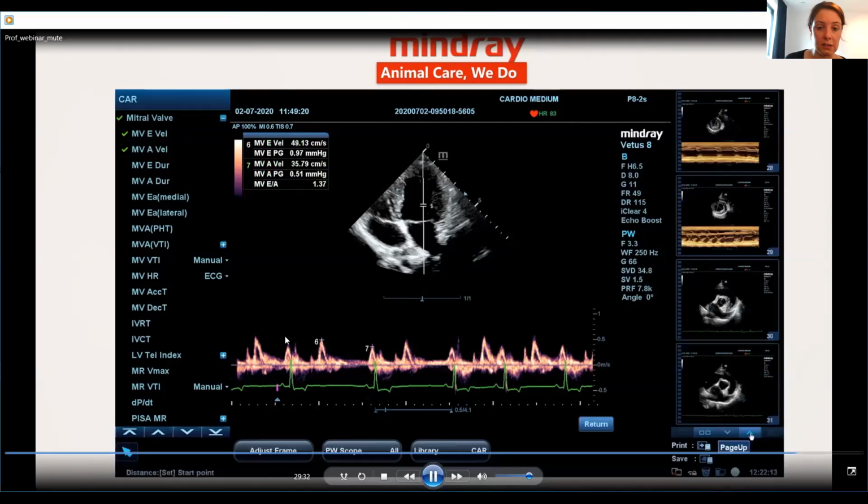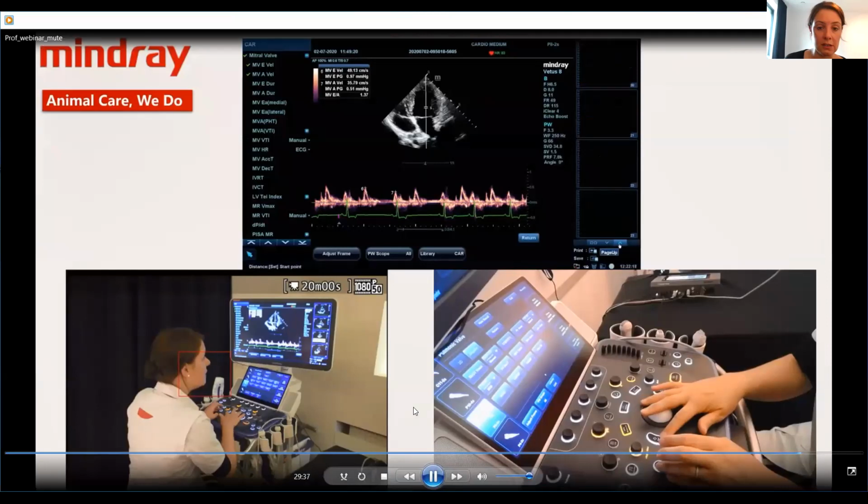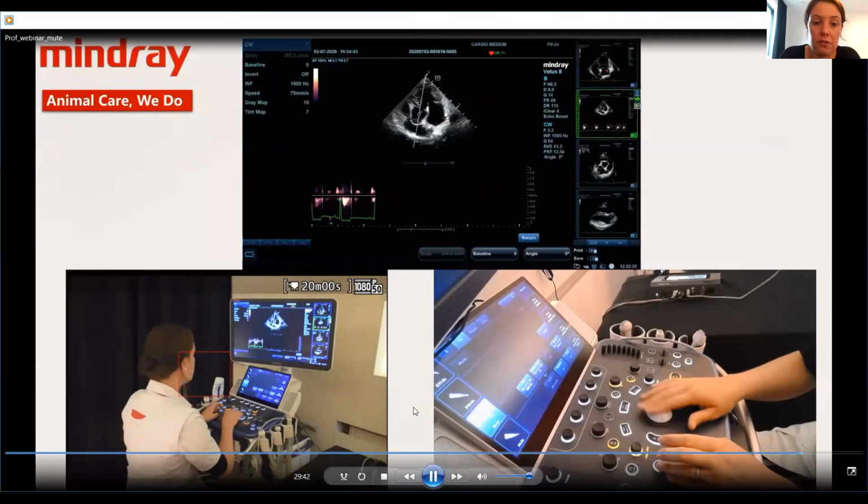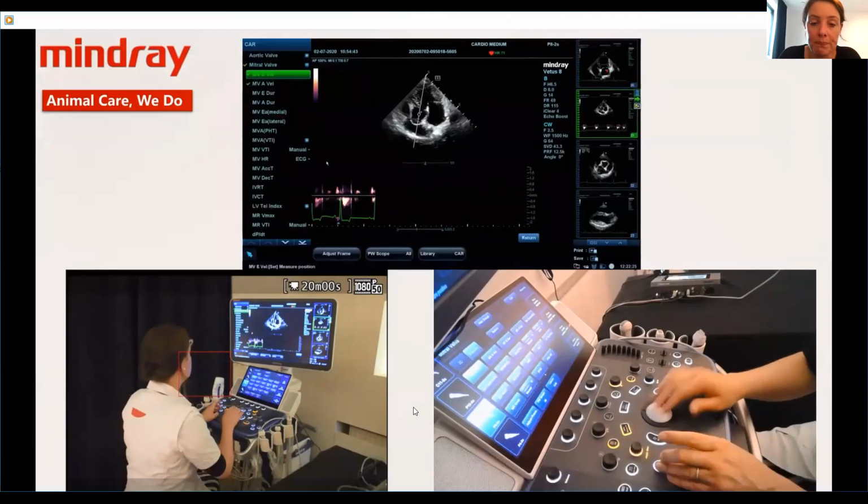Bigger than the A peak, but I'm not going to go into detail because that leads us to a discussion of the assessment of diastolic function, which is not the aim of this webinar.